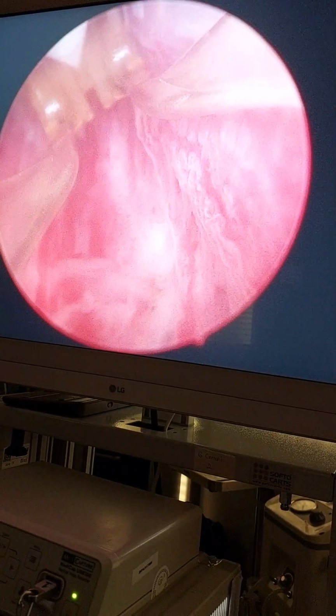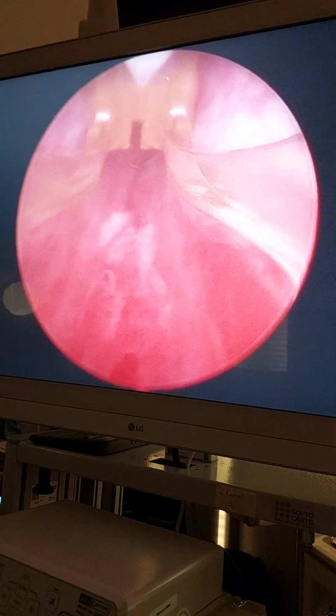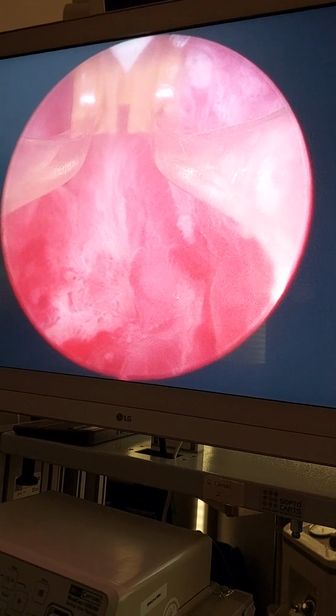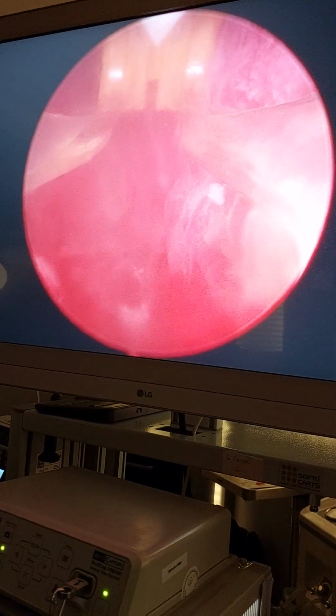Still there's inflammation, most of it drained. I will do one more here. The left side was more affected, I think. Yeah, nice. Look, now vision is better. You see, these tissues are affected with hot steam. Yeah, less is better, they say. And 2 to the left side, 1 to the right, 1 to the bladder neck.